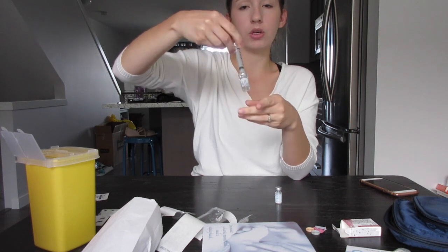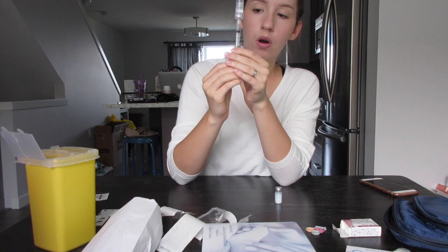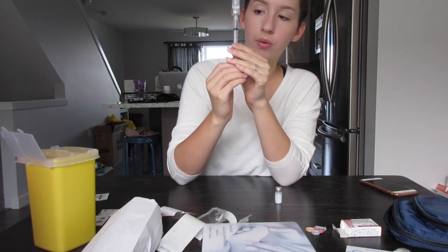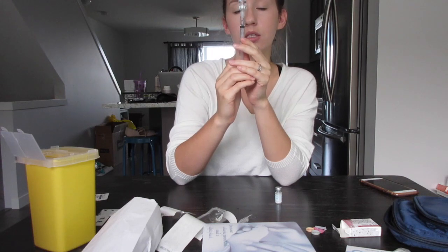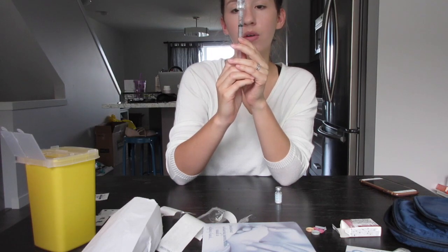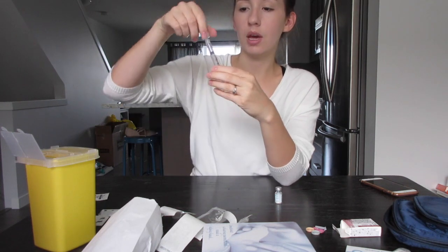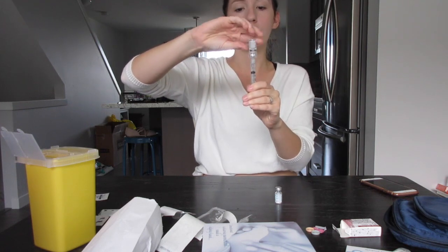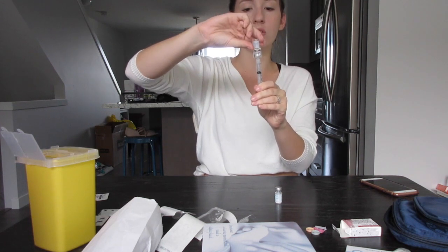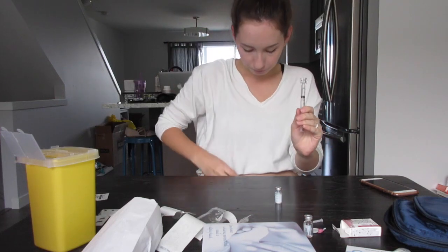Okay, so now when you flip it up, the water or the solution will seamlessly come through. So you're going to go down to number one. That's my dose, obviously depending on your dose. Okay, so when you're at number one, you can pull the vial off. You want to leave the Q-cap on because you still need it, but you just want to pull the vial off. This vial is now done.